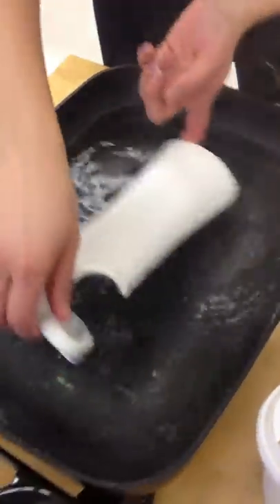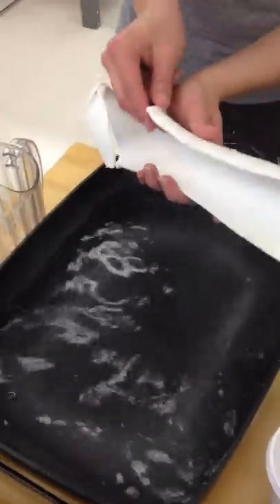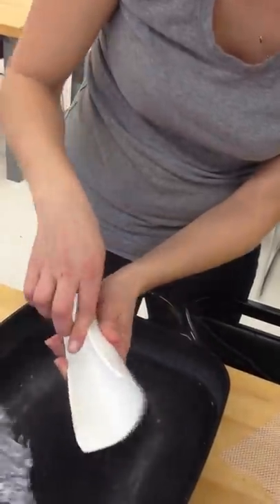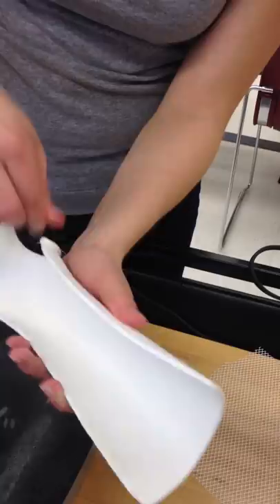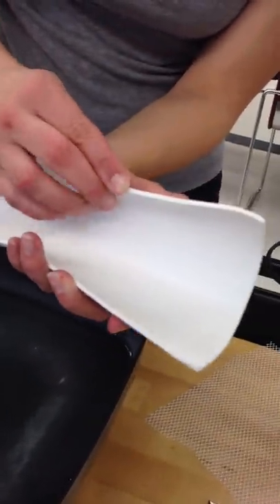Watch in the splint pan how I do this. If you get all your areas too hot, you're going to lose your shape. If you use the heat gun, a lot of times you're going to lose your shape because it gets too hot. So I'll just get it a little warm and rub out the spots. Nice and smooth — then I'll do it again.